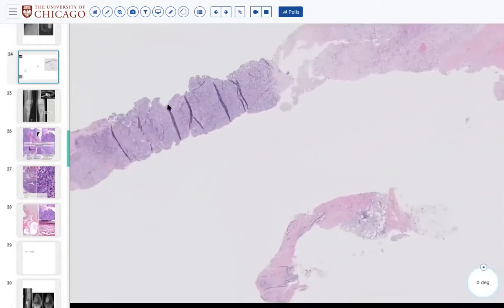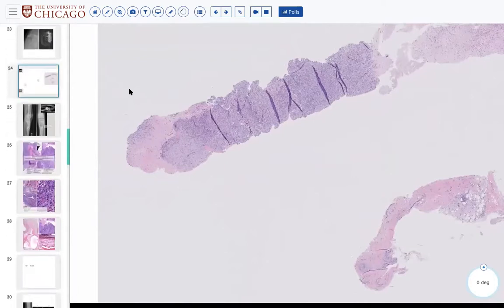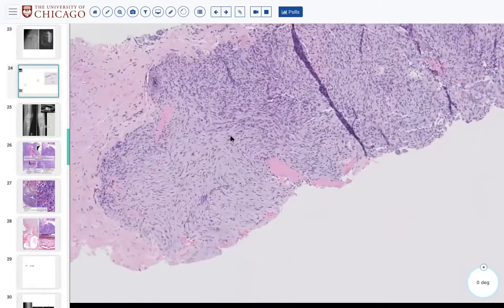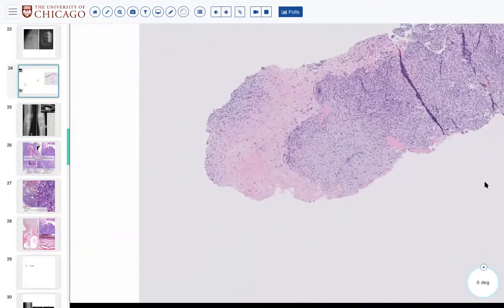All right, so excellent. So a large lesion in the shoulder of this young person, youngish, 25 male. So somebody's already previewed FISA and is suggesting ABC. So tell us what you saw. Perry says non-ossifying fibroma. All right, let's start with FISA. Tell us what you saw.